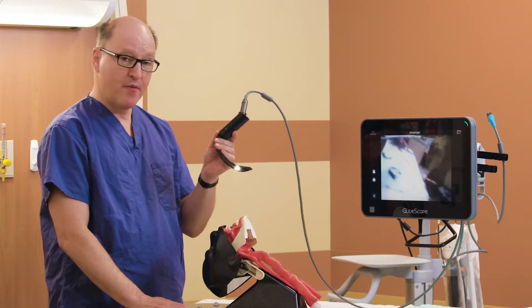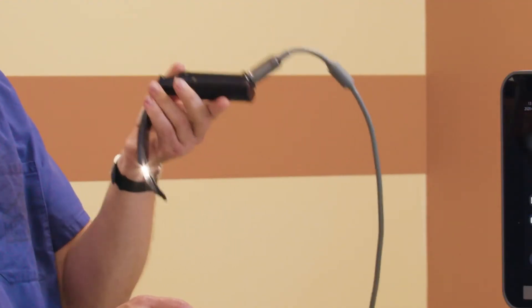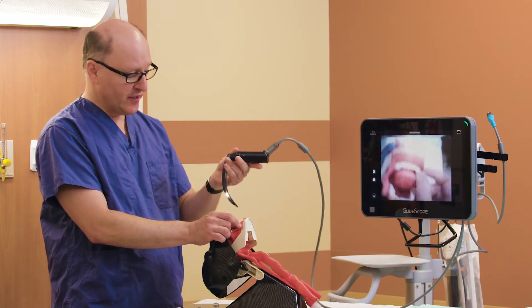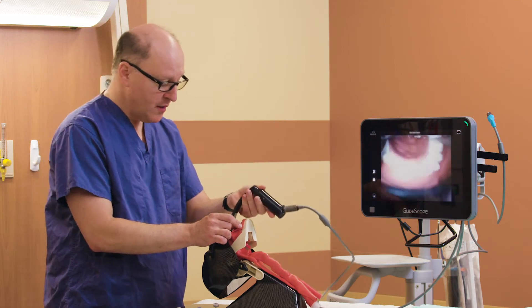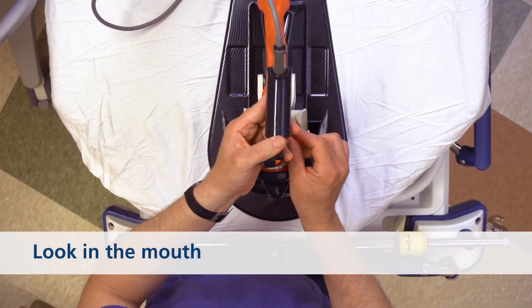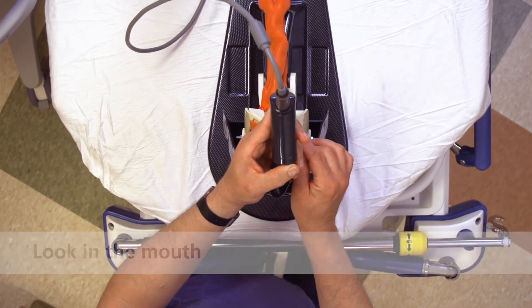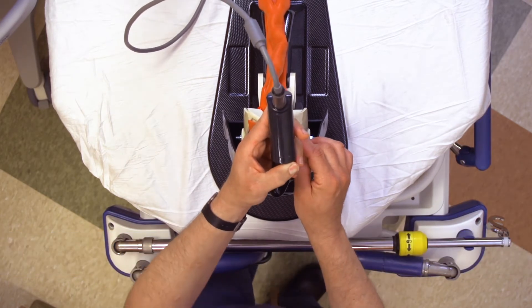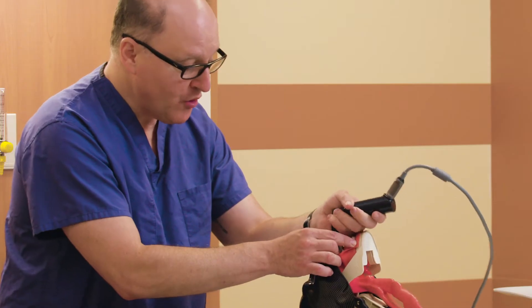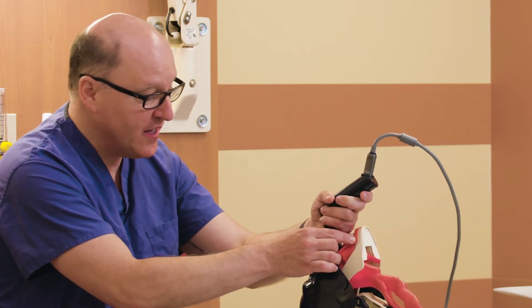When I perform direct laryngoscopy with a Macintosh blade, and I'm going to not look at the monitor at first, I go in, I go midline, the uvula points to the epiglottis, I control the tongue, and now I'm seeing the epiglottis edge, and I'm lowering myself down to get into the line of sight.